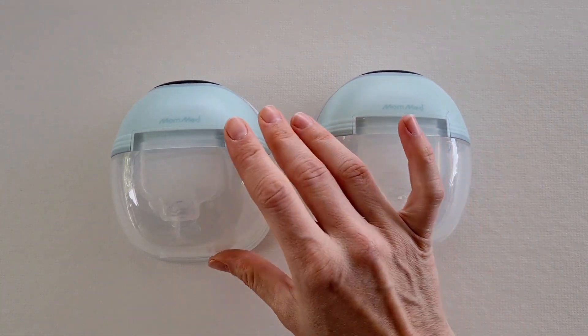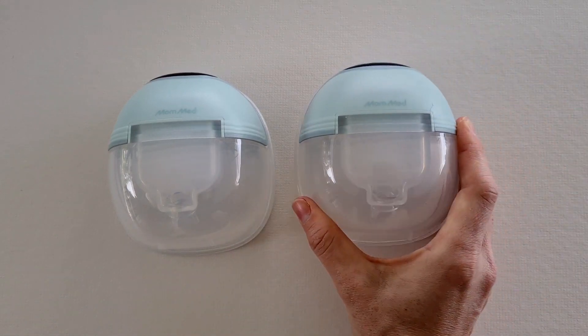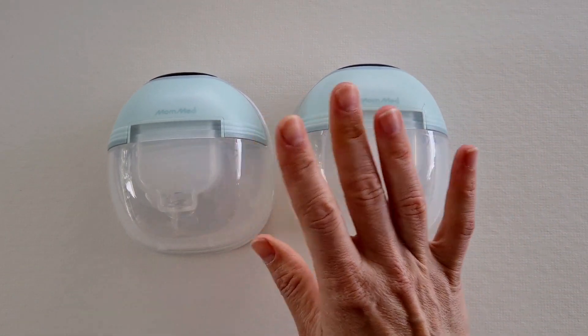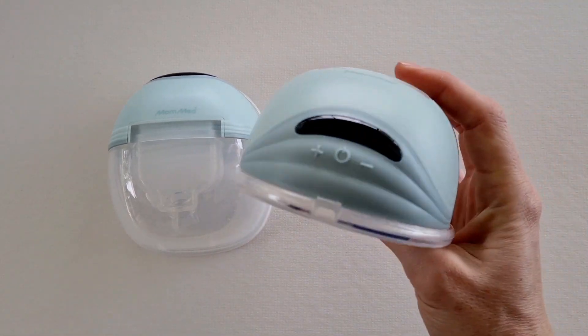This feature is great if you are a part-time pumper or you want to wear it full-time. You can have one on recharge — there are so many options. You don't have to worry about which is left and which is right, which is a big plus for me.